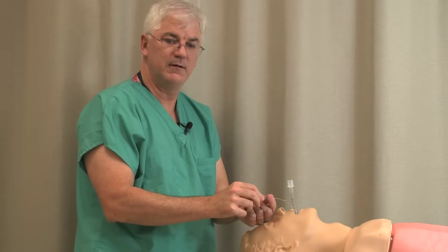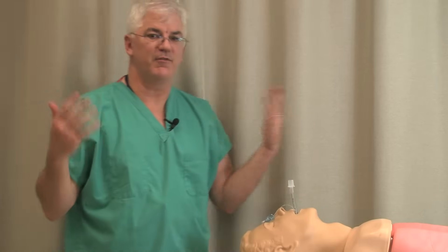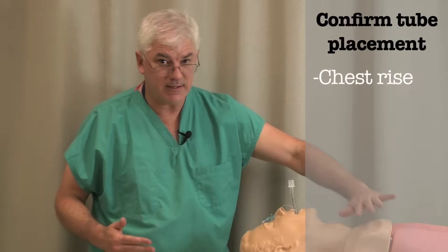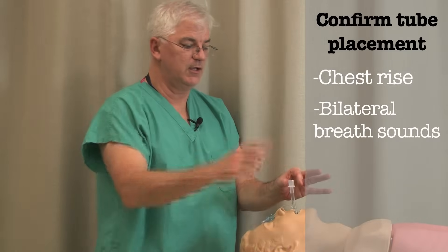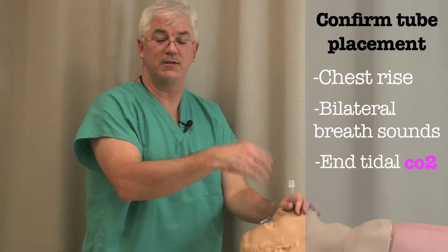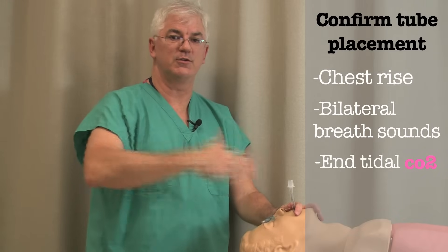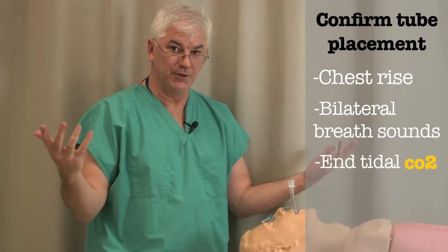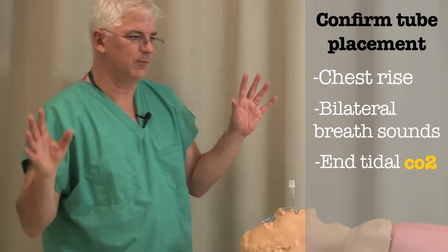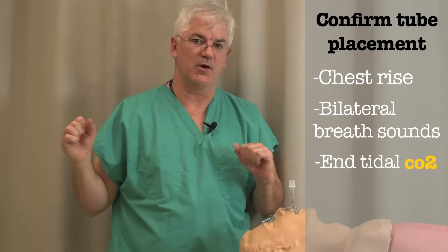Then you're going to inflate the pilot balloon and make sure that you're in the right place. How are you going to know you're in the right place? You're going to see the chest rise. You're going to hear bilateral breath sounds. You're going to hook up an end-tidal CO2 monitor — the usual portable kind goes from a purple color to a gold color, so you'll say 'we're golden.' So you make sure you're in the right place, then hook up your ventilator.